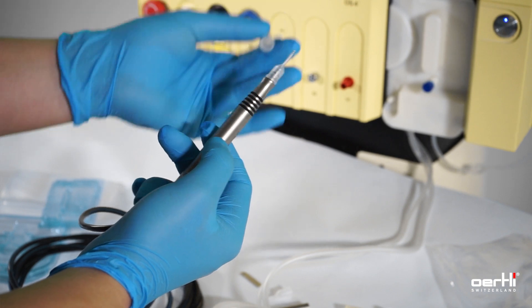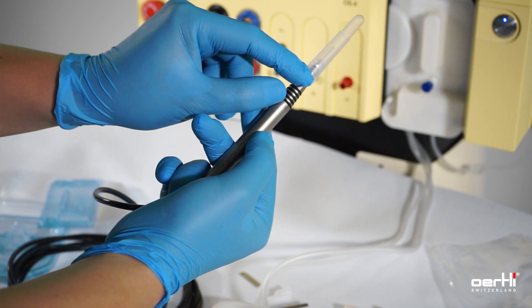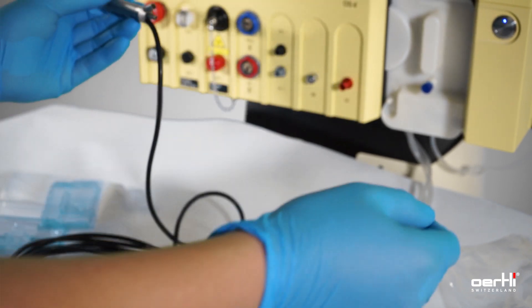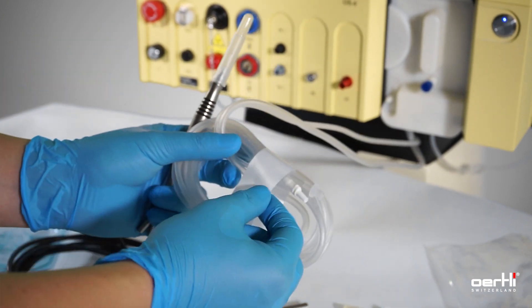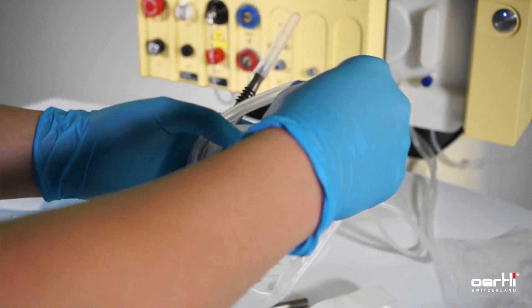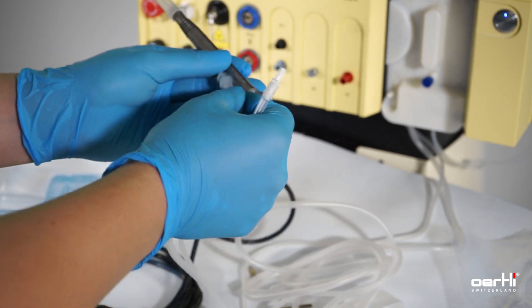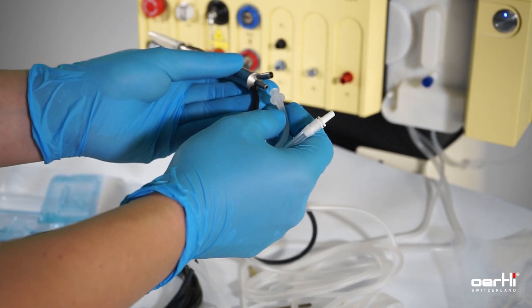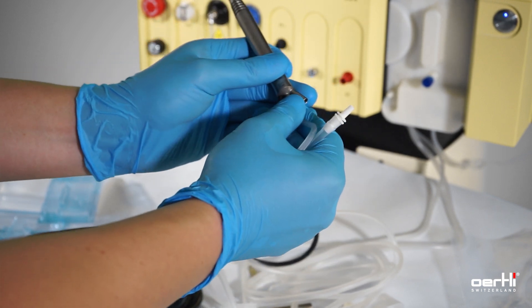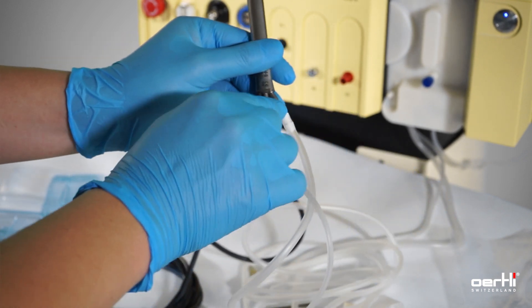Finish it off by using the test chamber until you touch the titanium part — then it's okay. Remove this part here. Use the irrigation line and aspiration line to finish off the FACO handpiece installation. We suggest using first the aspiration line, as there is more space, and then the irrigation line.